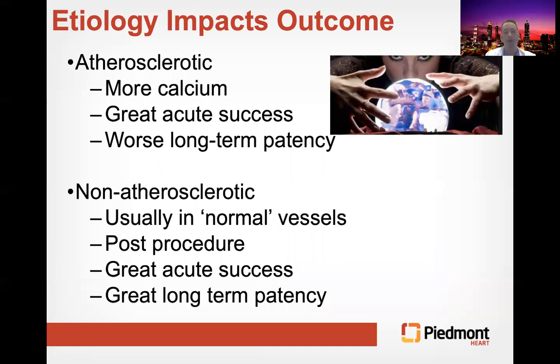I think it's also very important when you're talking about common femoral intervention that really the etiology of the common femoral disease impacts the outcome. If it's atherosclerotic and it's more calcified, you can do pretty well with acute success, but worse long-term patency.